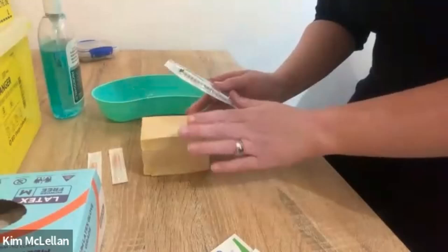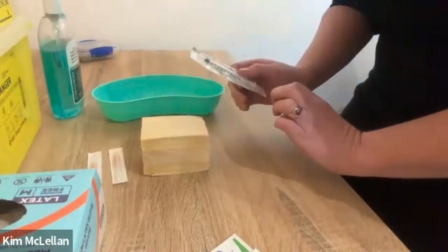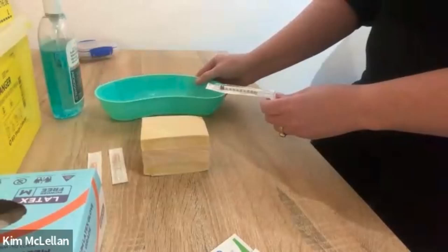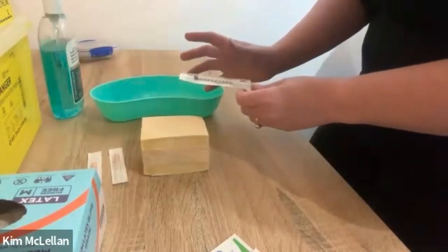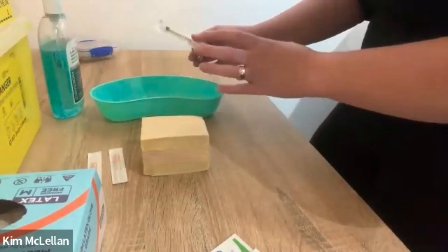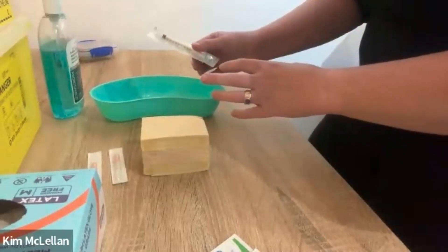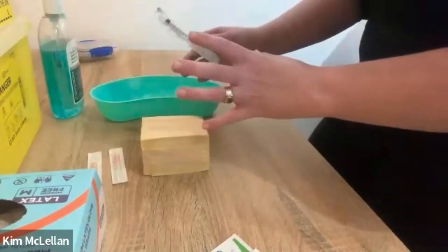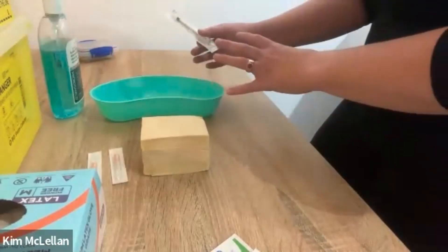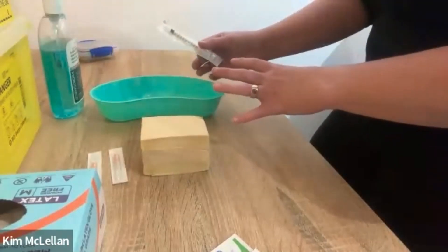We have our fake abdomen here where we're going to be administering our medication. When drawing up insulin, two nurses need to check the insulin before you administer it — that is the protocol in New Zealand. So once you've done your medication draw up, you need to get another nurse to double check that they're happy with it.